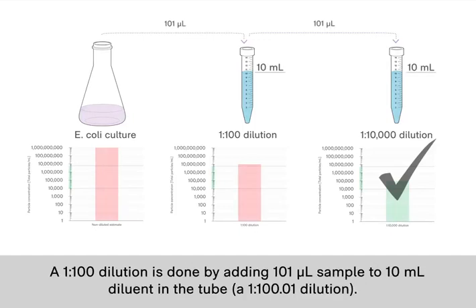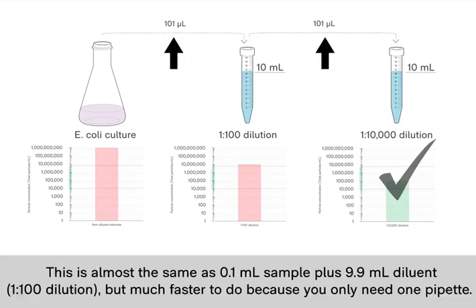To do a 1 to 100 dilution, you can simply add 101 microliter of sample to the 10 mL diluent in the tube. This is almost the same as 9.9 plus 0.1, but it's much faster to do because you only need one pipette.